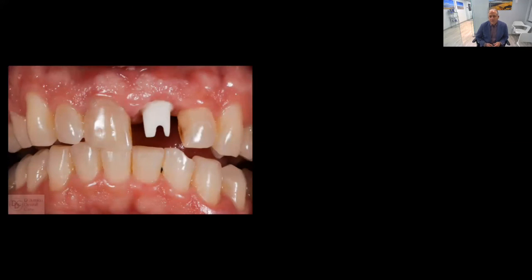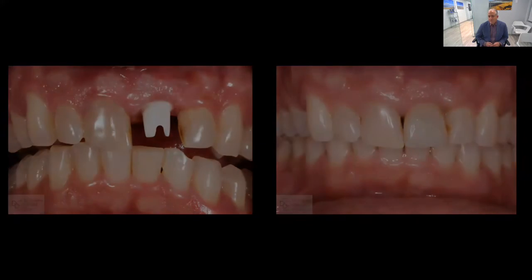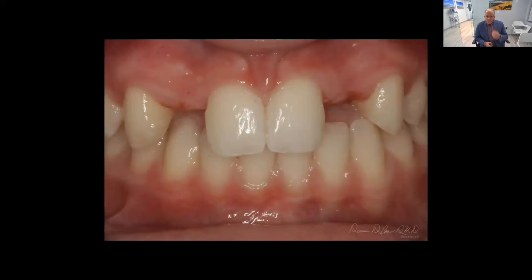And that's exactly what happened. So here's my final zirconia custom abutment, and you can see that that tissue is really kind of falling into place nicely, and now the gingival zenith is pretty much the same in both the areas. So this really kind of highlights, I think, the full gamut of what we're able to do with digital dentistry.